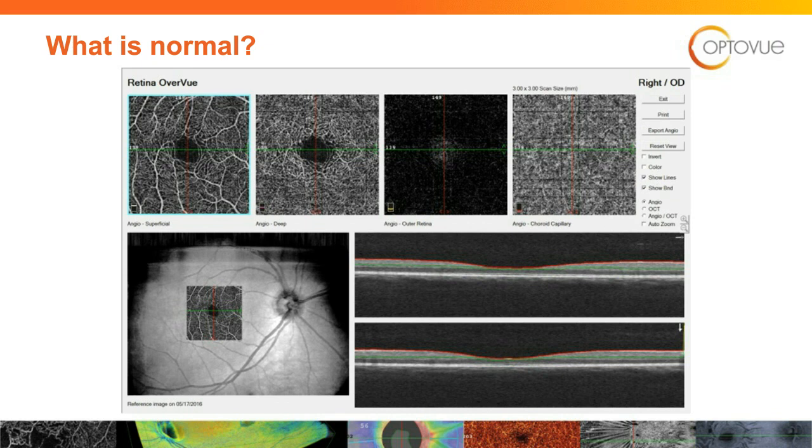You move over to the one on the far right, and now we've got the choriocapillaris, which is obviously, as we all know, densely vascular, and it's basically like a sponge of all of this vasculature, and you're going to see not the capillary network, but kind of that white vascular sponge, as you can see in the choriocapillaris there. What you want to remember, again, is that this is a very normal set of 4 segmentation slices, or en face slices, as you're going through this.